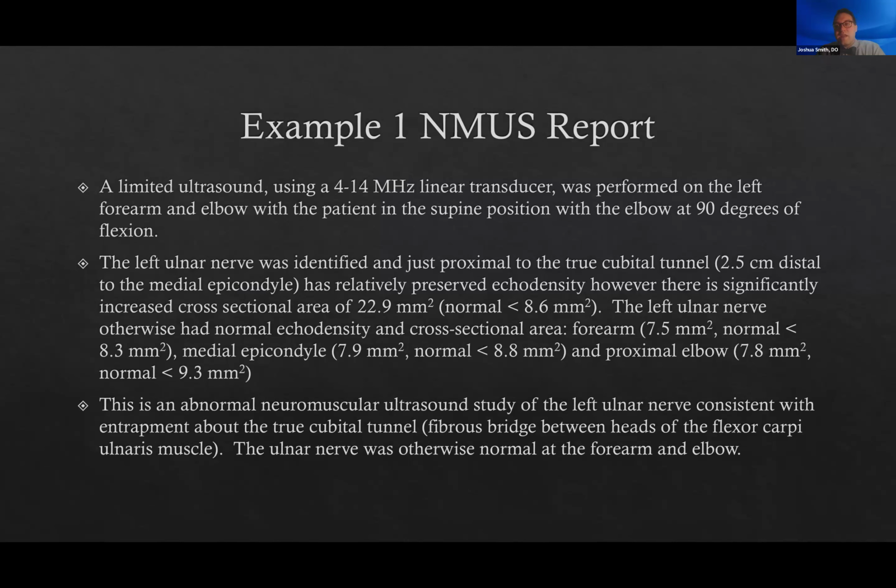I still think having the EMG and nerve conduction study is helpful. If the distal amplitude is preserved and it's mostly neuropraxia, time is on your side. If by the time they come in they have atrophy and they're denervating diffusely, time is more of the essence. This person is probably going to need surgery, but might also not have a complete recovery because there's already been some significant axon loss.